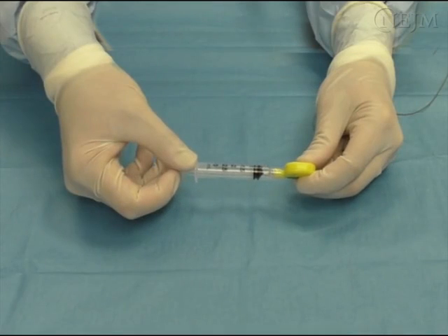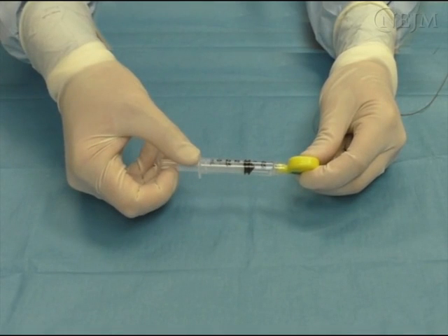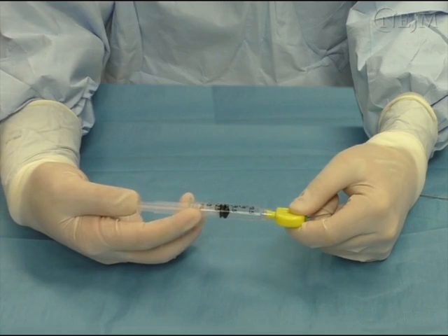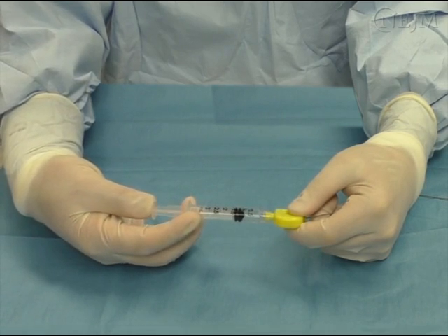First, aspirate the catheter with a syringe and look for blood or cerebrospinal fluid. The absence of blood or cerebrospinal fluid is a good indicator of correct placement, but it does not rule out intrathecal or intravascular placement. Second, inject a test dose through the catheter. Usually 3 milliliters of 1.5% lidocaine with a 1 to 200,000 dilution of epinephrine is used.